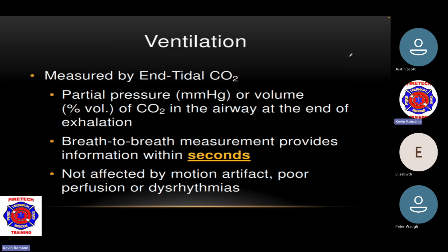If you look at our ventilation and measured by end tidal CO2 monitoring here, within seconds, you're going to see a change because the breathing is going to stop. And you're not going to be able to get those readings anymore, and apneic alarms will go off, right? So now you're going to see a true reading at the time things are changing. All right, we'll get more into the end tidal readings here shortly.